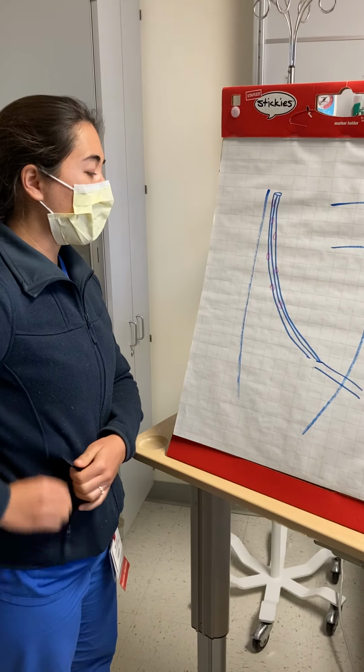So if we're assessing the atrium and what's coming out of it, first you can look at the amount of liquid you have coming out by looking at this chamber. You're going to want to look at the quality of it. So is it serous? Is it serosanguinous? Is it purely sanguinous? Is it purulent? And then we're going to look at how much is coming out.